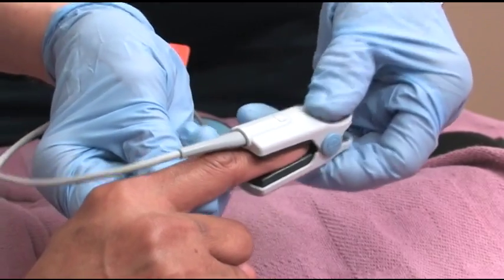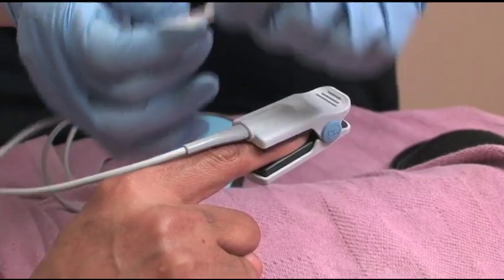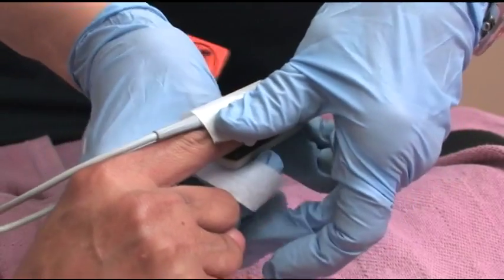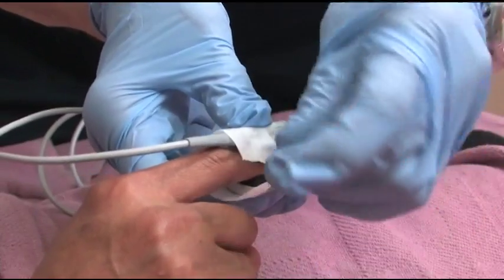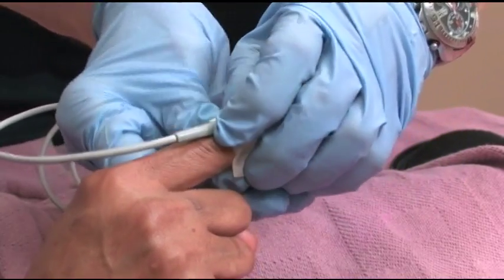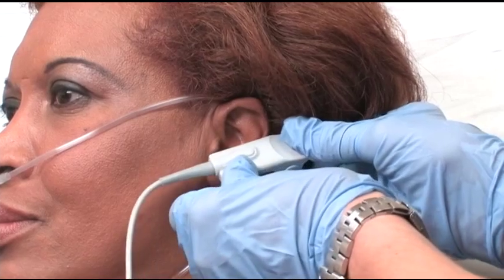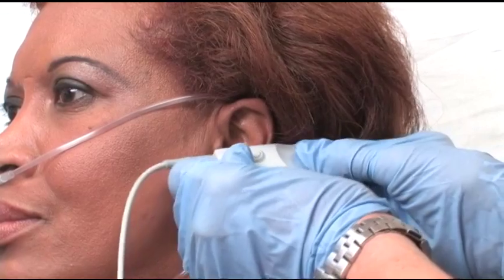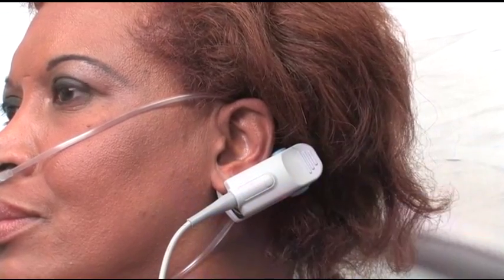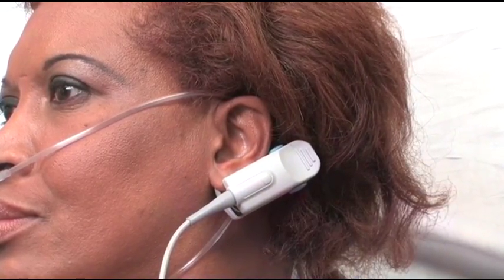Frequently monitor the position of the sensor probe. If you think the sensor probe may become easily dislodged, consider securing it in place with tape. If you are unable to obtain a reading, or if you get poor waveforms or a trouble indicator, consider repositioning the sensor probe or moving it to an alternate site. In patients with poor peripheral perfusion, the earlobe may be a preferable site for monitoring SpO2.